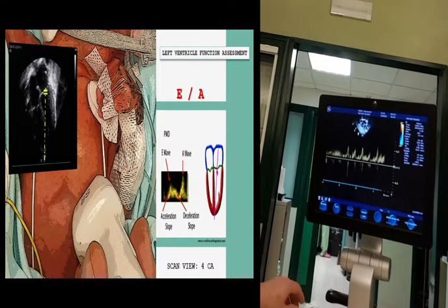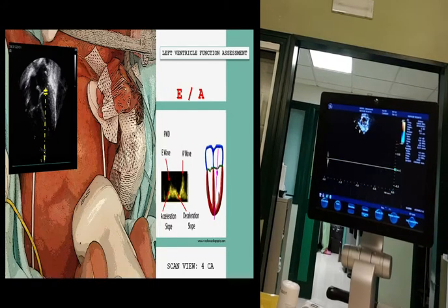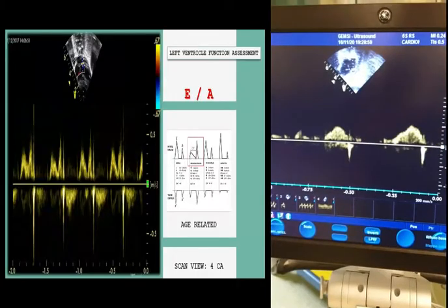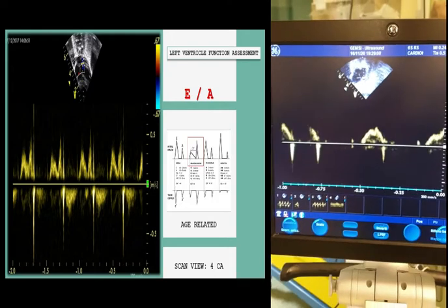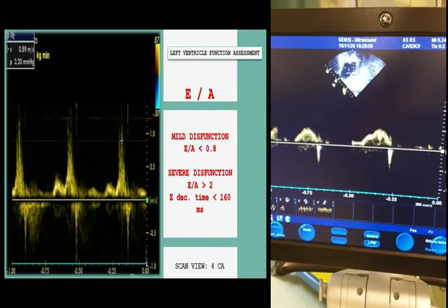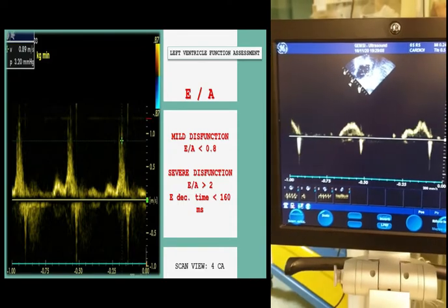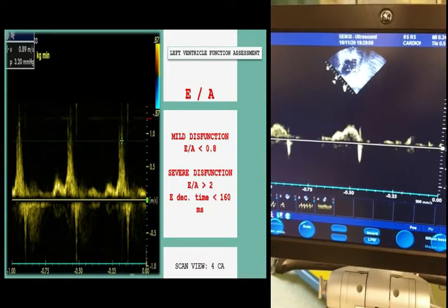Quantitative assessment of left ventricular diastolic function may be done by analyzing the Doppler spectral of mitral inflow or tissue Doppler imaging evaluation at the lateral mitral annulus. The pulsed wave Doppler across mitral inflow is composed of two waves: an E wave representing early passive ventricular filling, which is preload dependent, and an A wave representing late diastolic active filling as a result of atrial contraction. The mitral E to A ratio, velocity, and deceleration time of the E wave can be altered in patients with left ventricular diastolic dysfunction. Mild diastolic dysfunction is characterized by an inversion of the mitral early and late diastolic E to A Doppler waves with a ratio below 0.8. The echocardiographic parameters of severe left ventricular diastolic dysfunction include a mitral valve Doppler E to A ratio greater than two and a deceleration time of the Doppler mitral E wave below 160 ms.